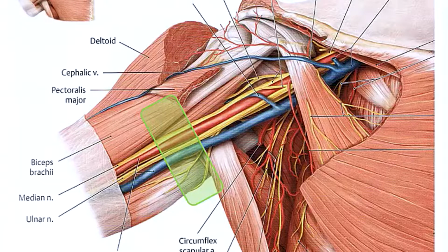So this conjoint tendon, which is the latissimus dorsi and teres major, will break the monotony of the image on the axillary. So you put the patient in abduction and then put the probe across mid-humerus, and then move it up and down. It's very boring because it has two channels. One channel is flexor, one channel is extensor, and the channel in the middle is neurovascular. Very little things change. A vessel joins another, or a branch comes out, but you go up and down, and nothing exciting. So muscle, neurovascular in the middle.